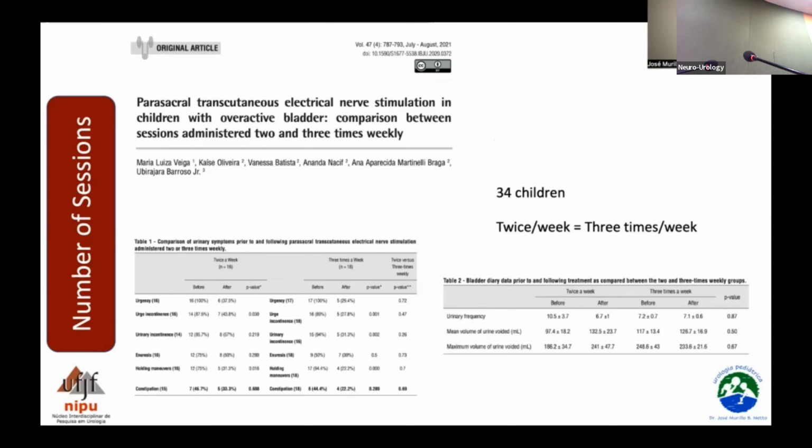And when the child does the neuromodulation at home, it probably doesn't go all the way up, because children with the parents, they feel a little bit more pain, and so they ask to do it at a lower intensity.